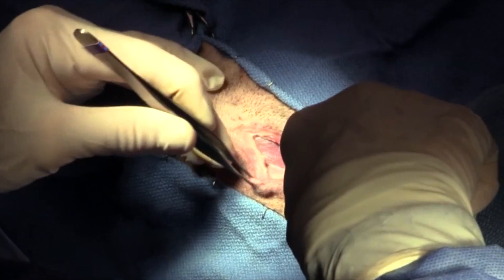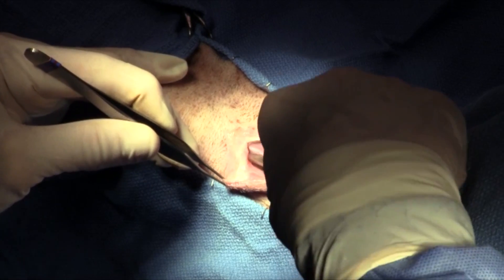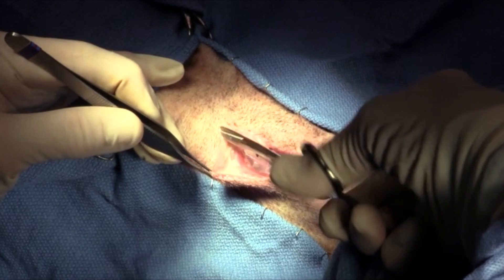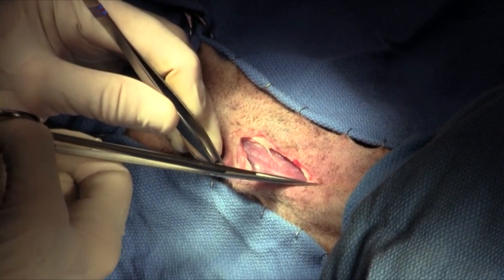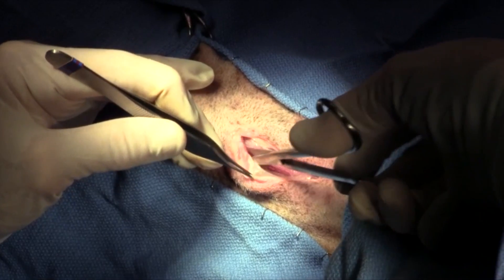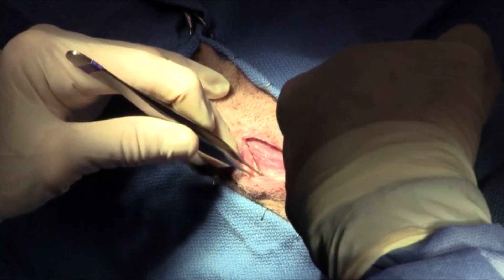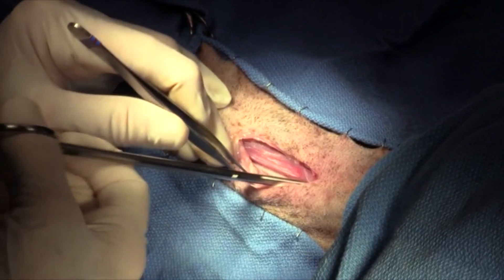The sternohyoid muscles are shown in this area by the tips of the Metzenbaum scissors. Division of the sternohyoid muscles on the midline between the two bellies of the sternohyoid muscle will bring you to the ventral midline of the trachea.